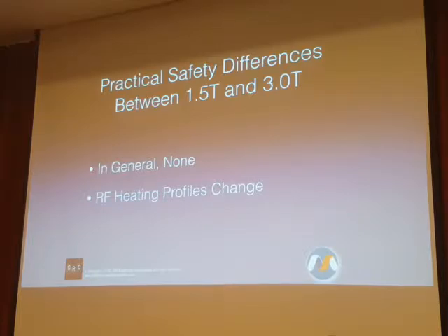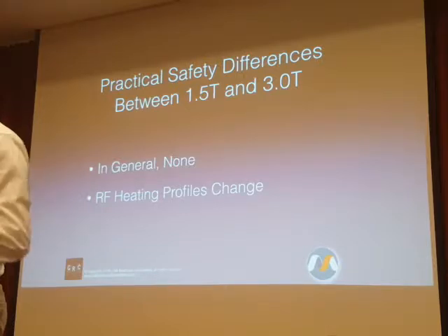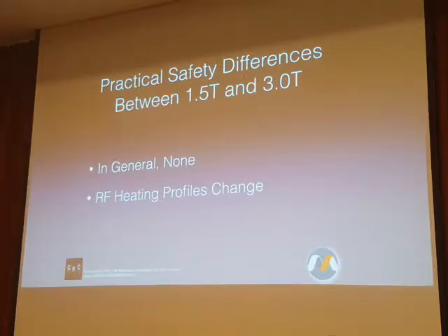So when we have fewer sine waves in a second, the distance between the peaks of the sine waves is longer. When we squeeze more of these into a finite space, a finite time, then the distance between the peaks gets smaller. The wavelength gets smaller. So higher frequency, shorter wavelength. Wavelength is what determines what is the perfect antenna.